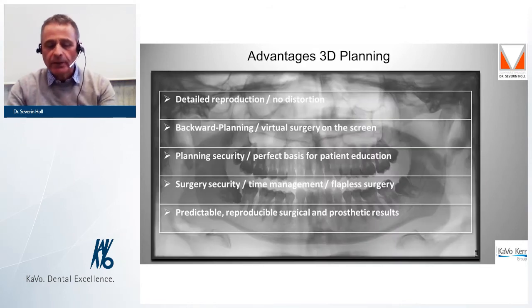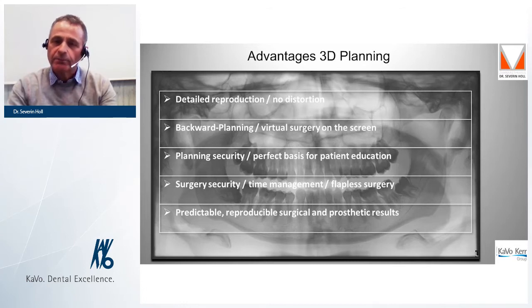Let us sum up the advantages of 3D planning. With the help of the cone beam, we get a detailed reproduction of the bone situation without distortion as in a panoramic image. We can implement the backward planning principle with the virtual implant plan on the computer.